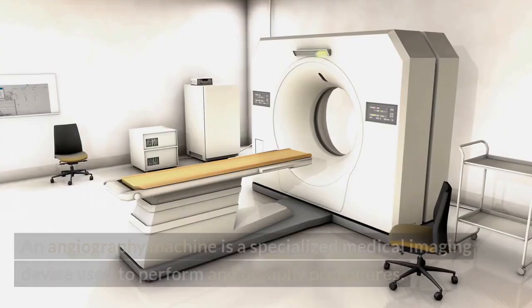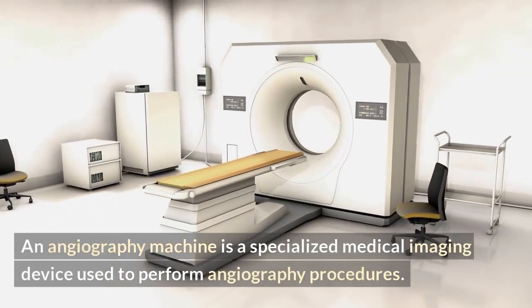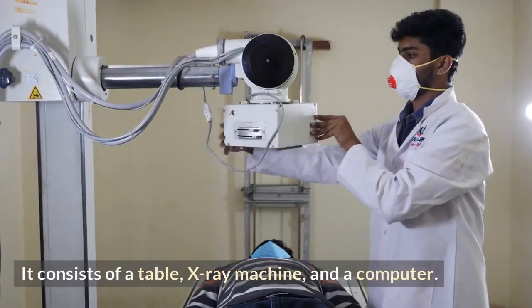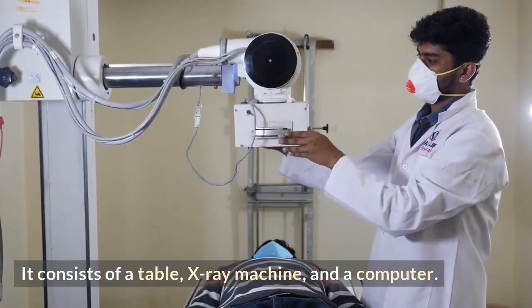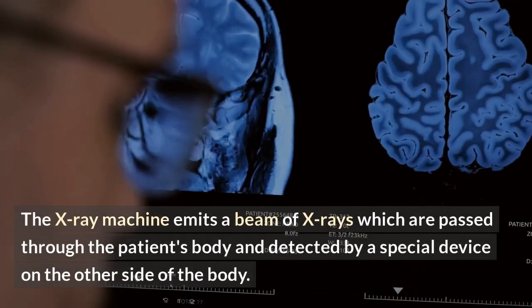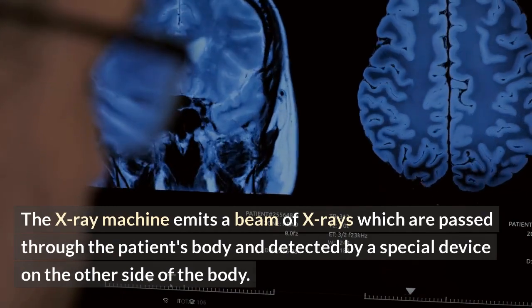Angiography machine. An angiography machine is a specialized medical imaging device used to perform angiography procedures. It consists of a table, X-ray machine, and a computer. The X-ray machine emits a beam of X-rays which are passed through the patient's body and detected by a special device on the other side of the body.